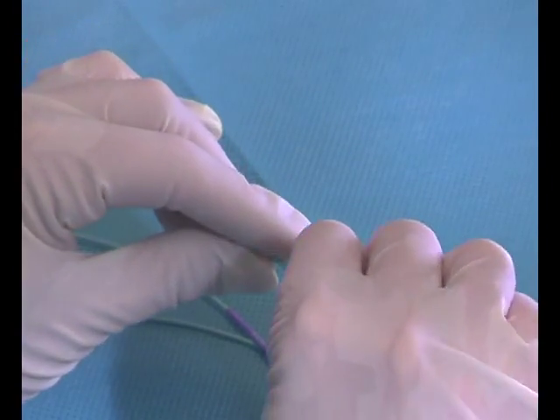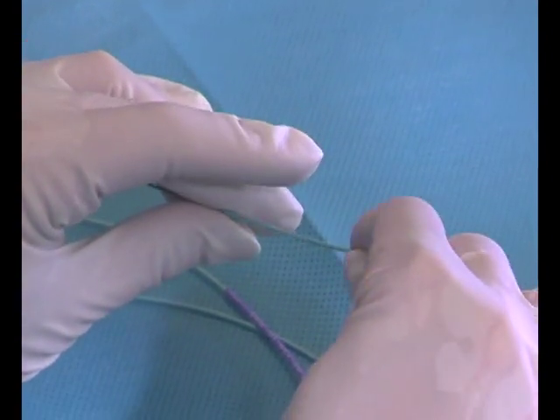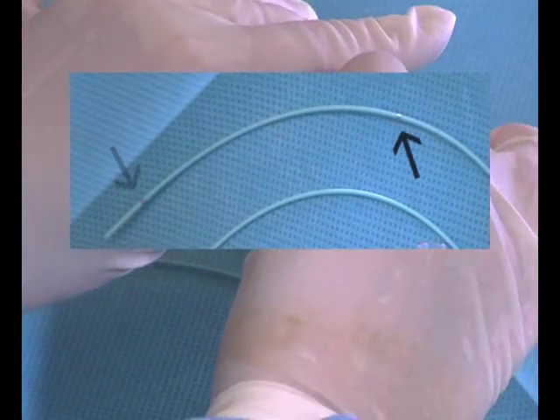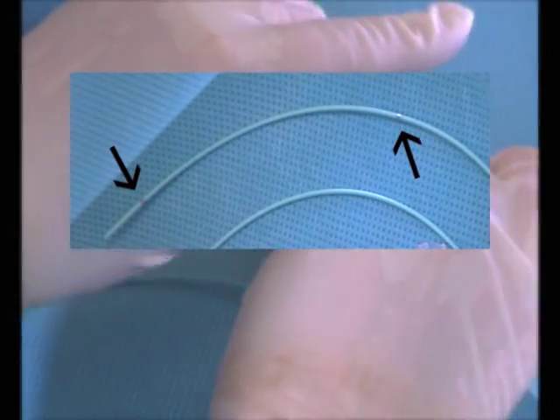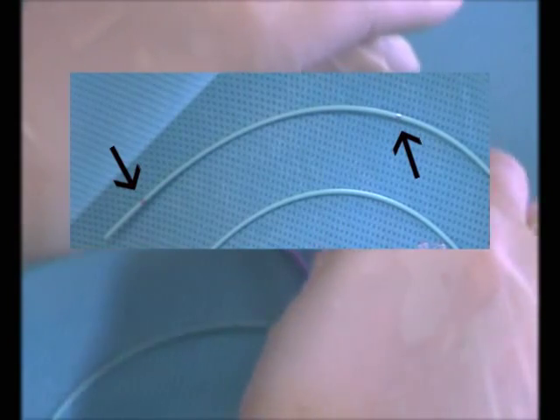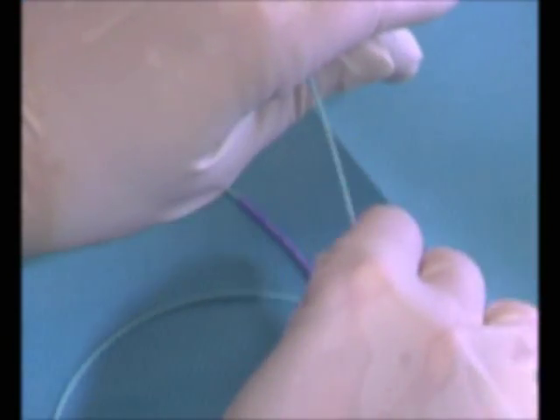The primed Fountain catheter and hemostasis valve should then be placed into the patient's vasculature over the diagnostic guide wire already positioned in the patient. Correct position of the Fountain catheter is determined by the clinician using fluoroscopic guidance and visualization. The radiopaque marker bands outlining the infusion segment should be placed within the intended area of the clot that is to be dissolved.